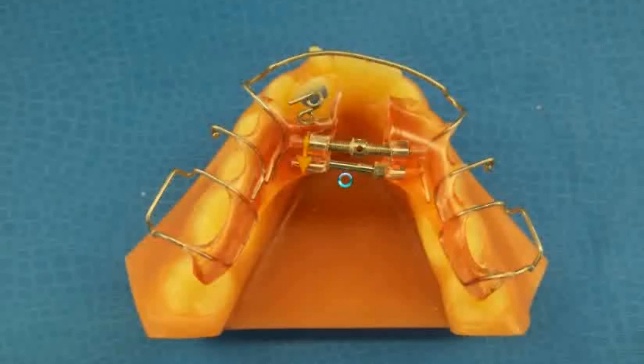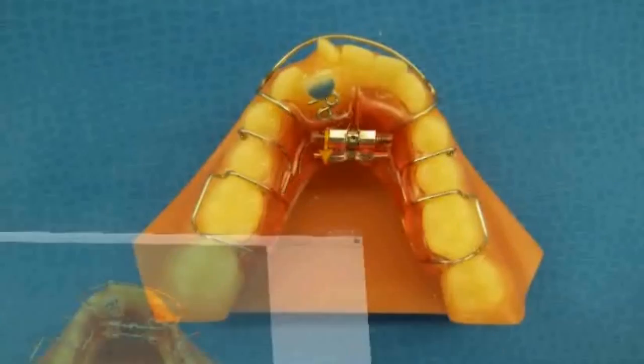You can use this appliance as a retainer, but you'll need to fill in the acrylic cut with acrylic to help strengthen the appliance. If you want to get started with the straight wire treatment right away, you can transition into a fixed holding arch to maintain your development. The lingual arch will prevent the arch from relapsing as you begin straight wire treatment.